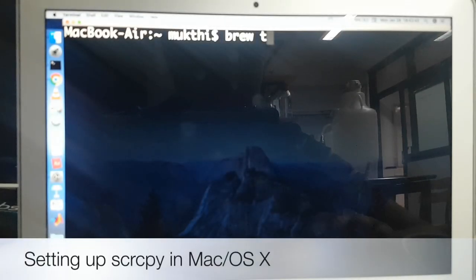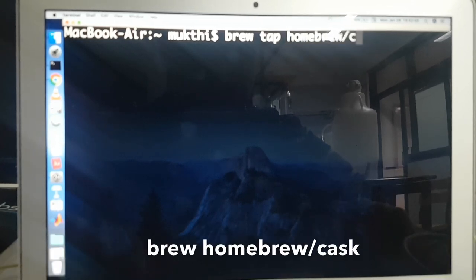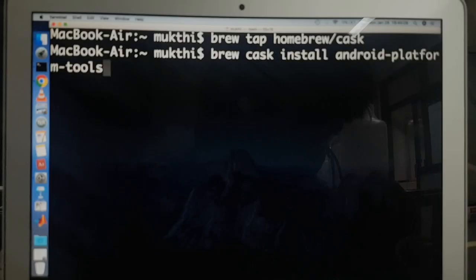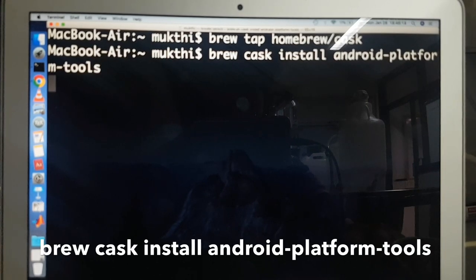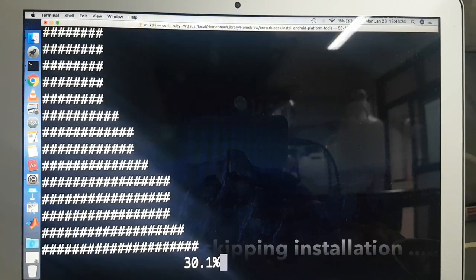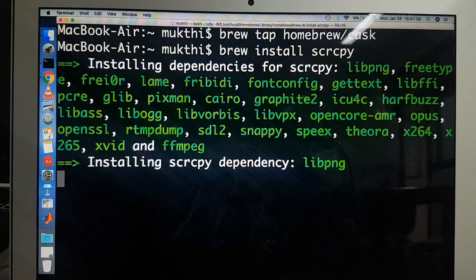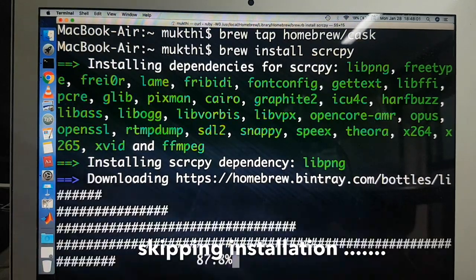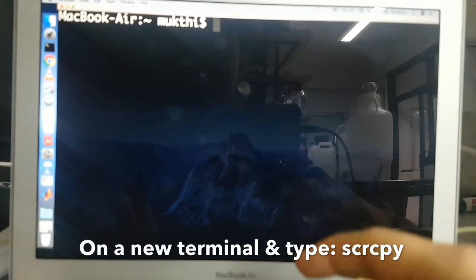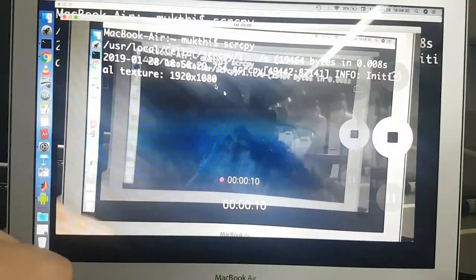So installation on Mac is relatively simpler. Just open a terminal and type brew tap homebrew/cask and press enter. Now type brew cask install android-platform-tools. Basically scrcpy runs on ADB base, so it requires those Android platform tools. And just type brew install scrcpy. This will take a pretty long time because it installs all the dependencies. I will just skip this step. And once installed, open a new terminal and type scrcpy. And yeah, the phone connects.